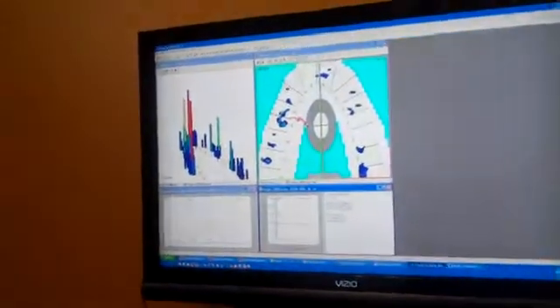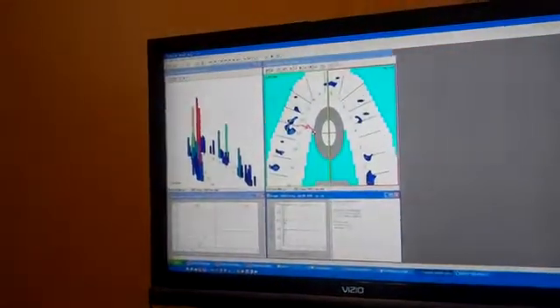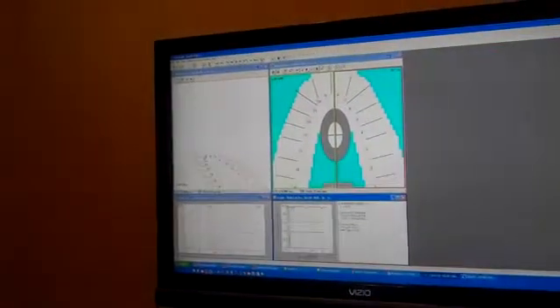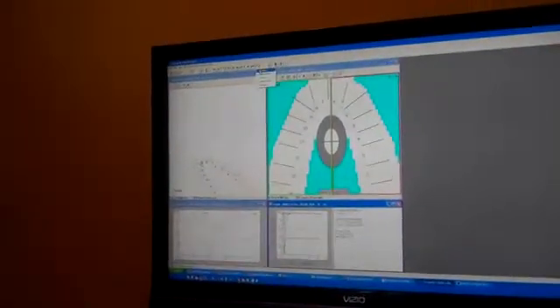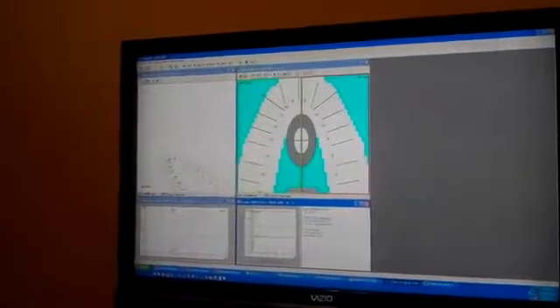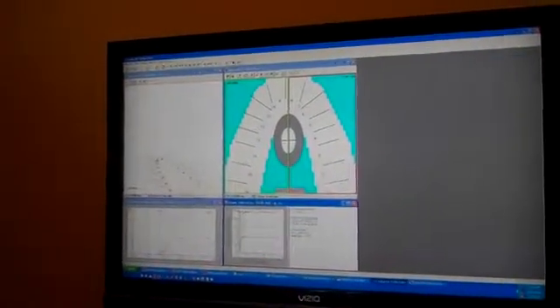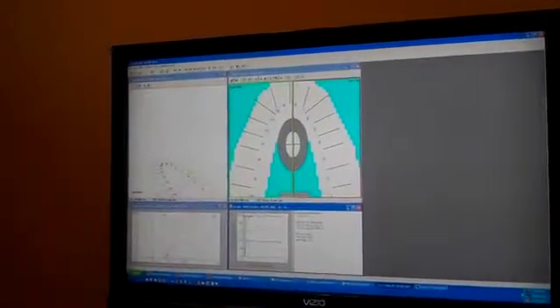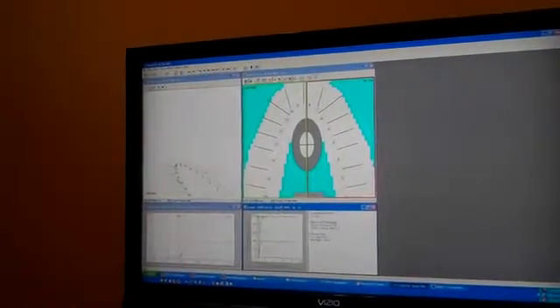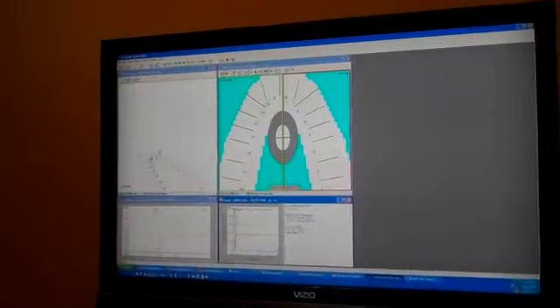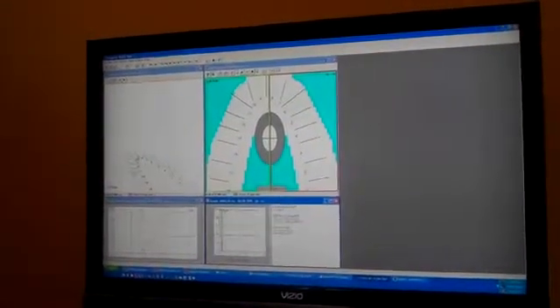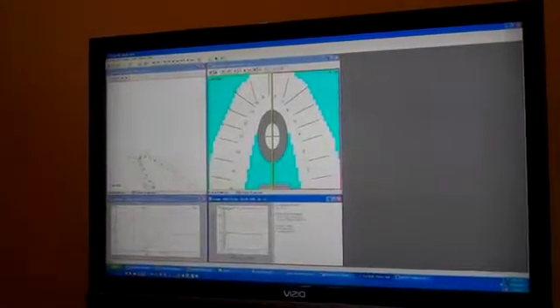So in front of us, we're looking at a graph of a patient recorded this afternoon. I'll just rewind from the beginning and narrow it to what's happening in this particular situation. When the patient first touches, this is the intensity graph, and we learn from here where the teeth are meeting first and how much force is being applied.